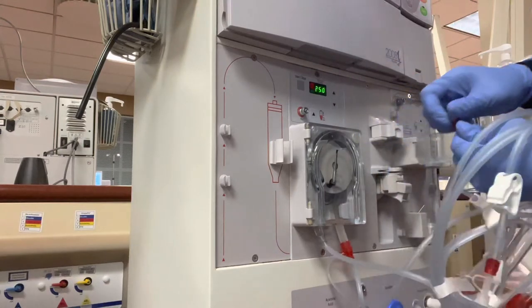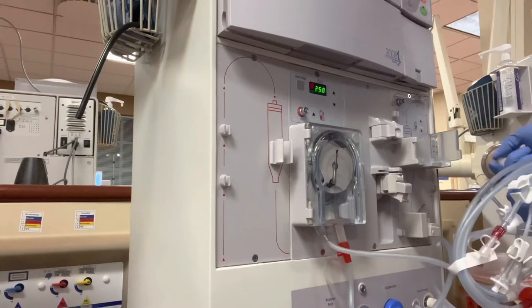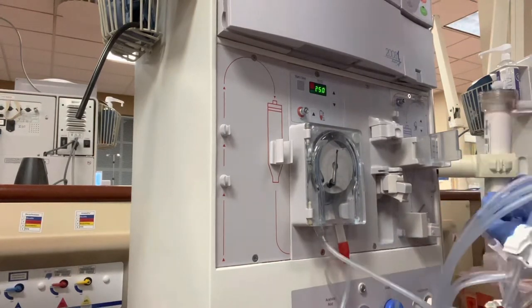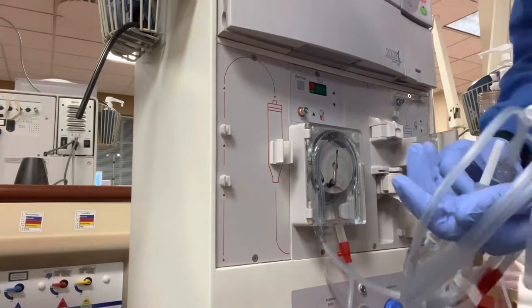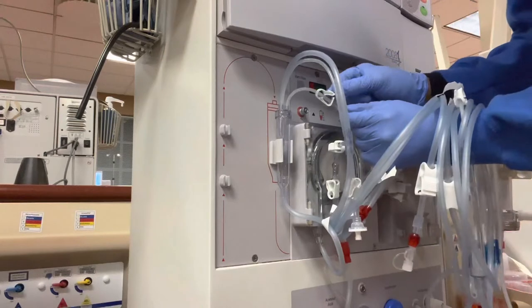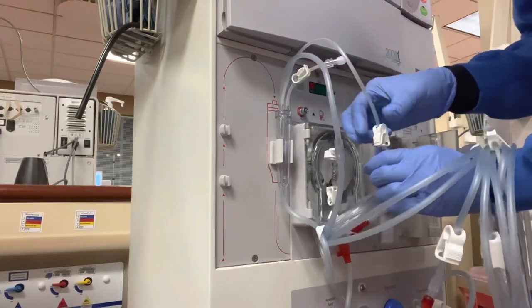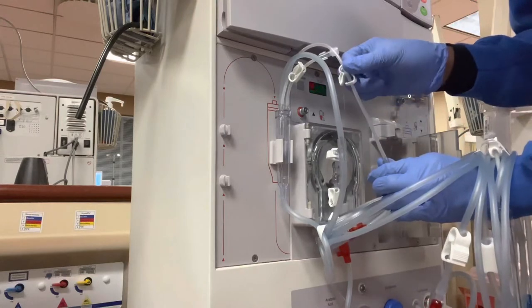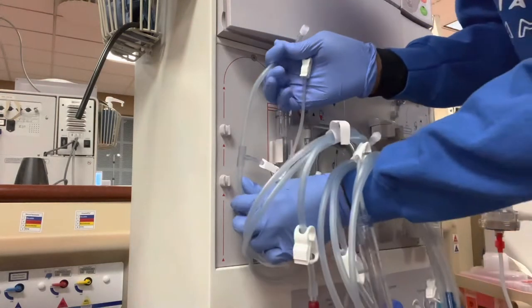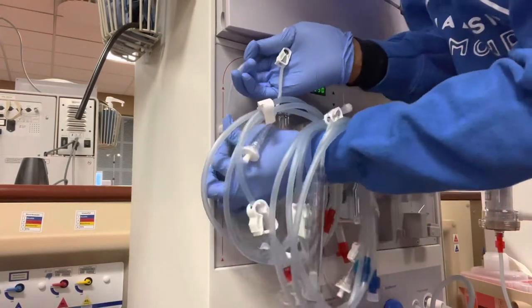Arterial, the red, is going on the dialyzer. Arterial chamber, clamp the tail, clamp the transducer line. The T line in.